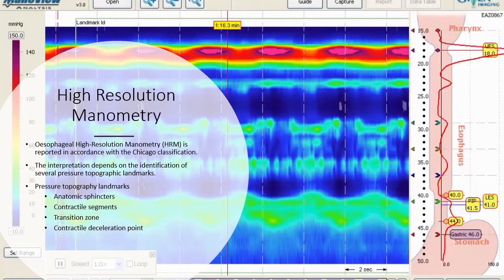Esophageal high-resolution manometry is reported in accordance with the Chicago classification. The interpretation depends on the identification of several pressure topographic landmarks.